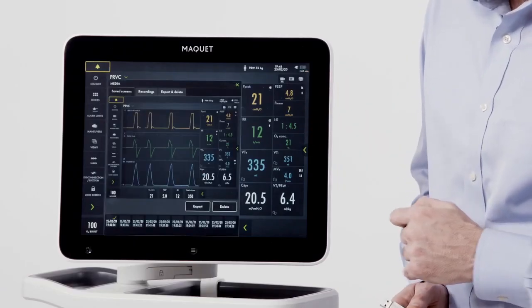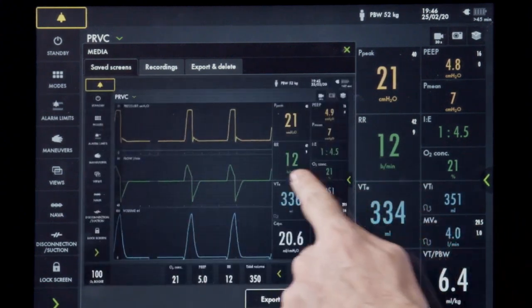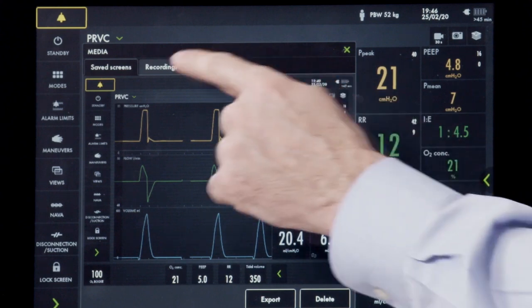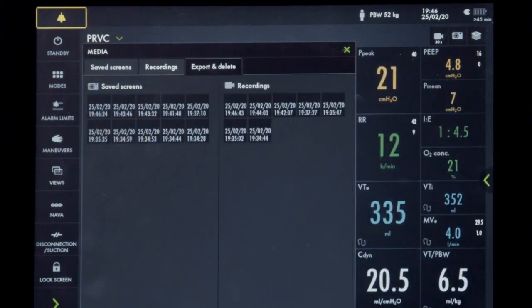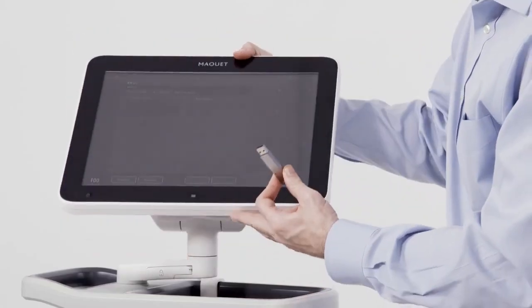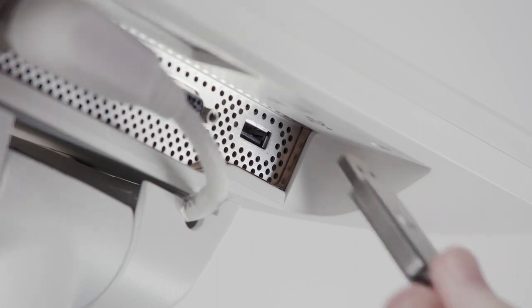Once pressed, my first tab is for saved screenshots that I can cycle through with my finger. The second tab is for recordings that I've captured. The third tab is to export data. In order to export data, I need to utilize the USB port underneath the screen. Once the USB stick is inserted, press export.